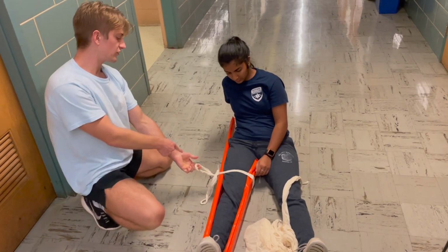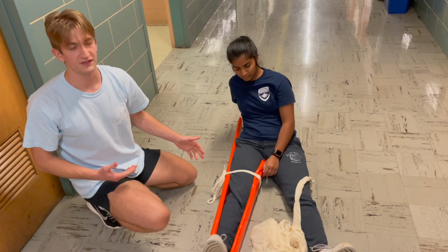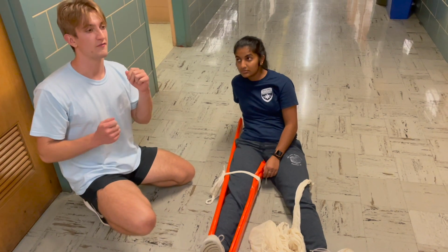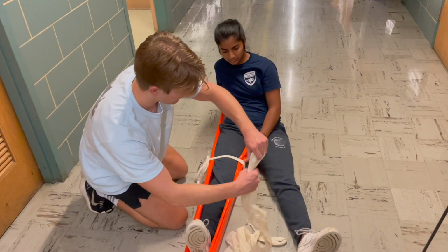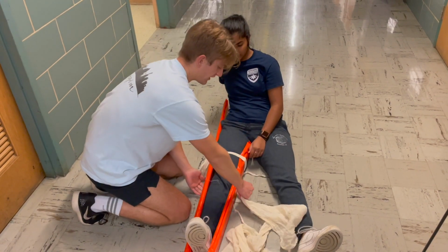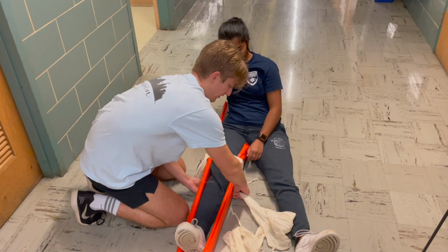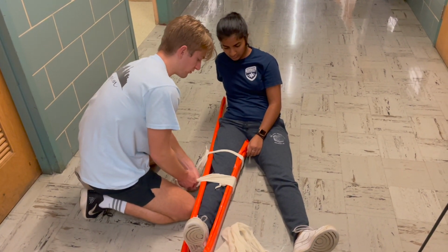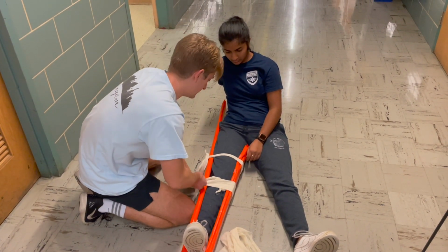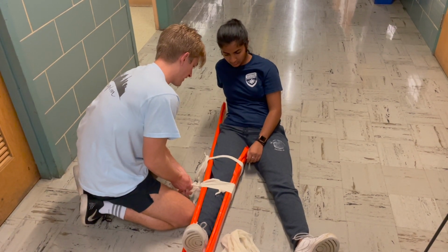And here I tied a little bow just so that it's easier for me to untie at the very end, but in the field you can just tie a knot, tie it tight, because we do not want it to come undone. Next, I'll tie just under the knee but above my fracture, which is in the middle of the tibia. I'll wrap around both boards and around the whole leg and tie just a regular knot.